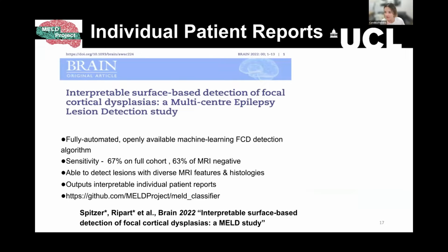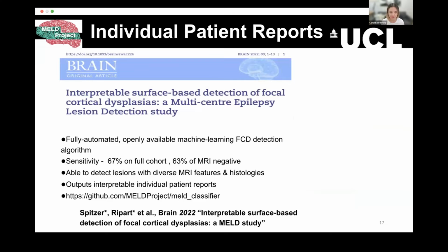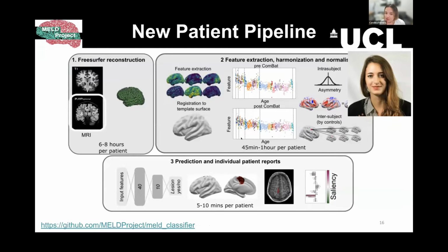Konrad, do you mind if I ask you a question before you? Please. So regarding the harmonization group, do you think it's better to select scans that are representative of your cohort or scans that are outliers, that have all the bias, all the movement, that are from different scanners to make sure that everything is kind of included, taken into consideration?